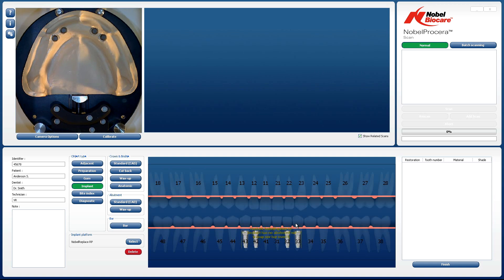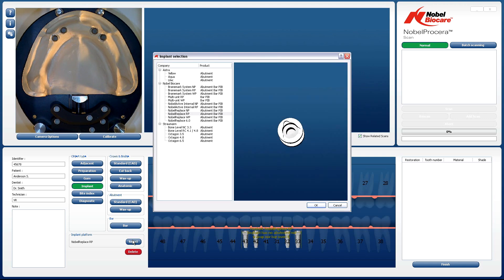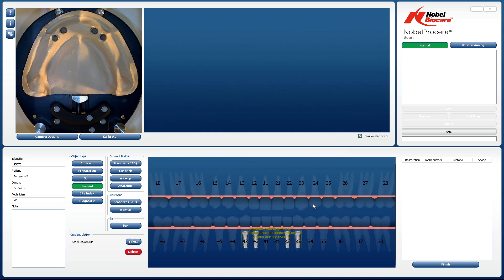If there are additional implant types present on the model, these will need to be selected. Left-click and the implant select box will then reappear. Choose the correct implant platform and size and then click on OK. Once all the implant positions have been placed on the tooth chart, the next step is to establish the bar span.